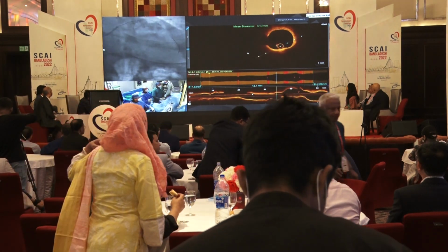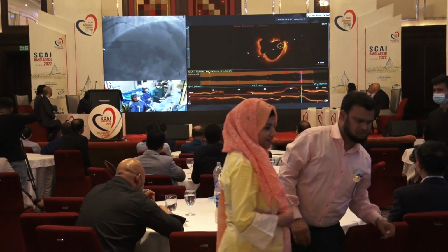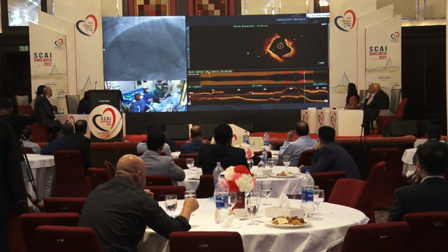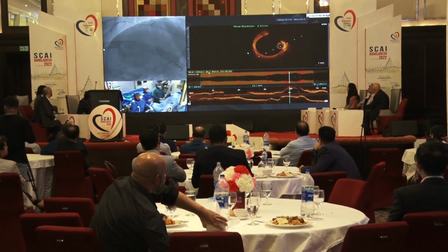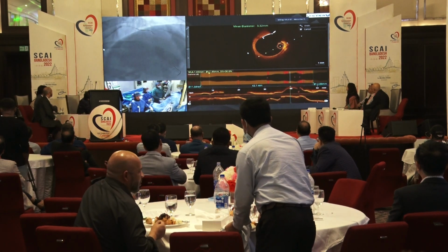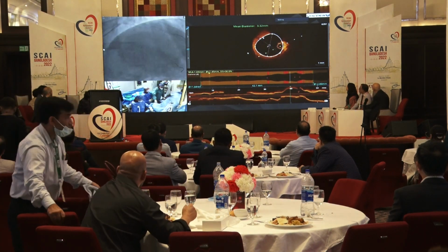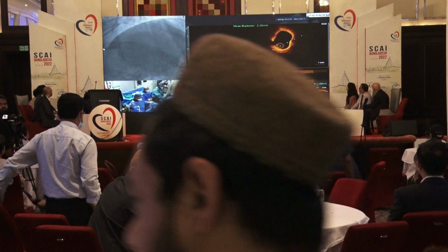Yes, probably we are lucky because the proximal part of the LAD is not so diseased. It's not bad, the proximal part is a nice lumen. There is some disease, but the residual lumen is very large. So where we have the significant narrowing is where we did not do the OCT, more distal. 8.5. So with an area of 8, I think there is no need.